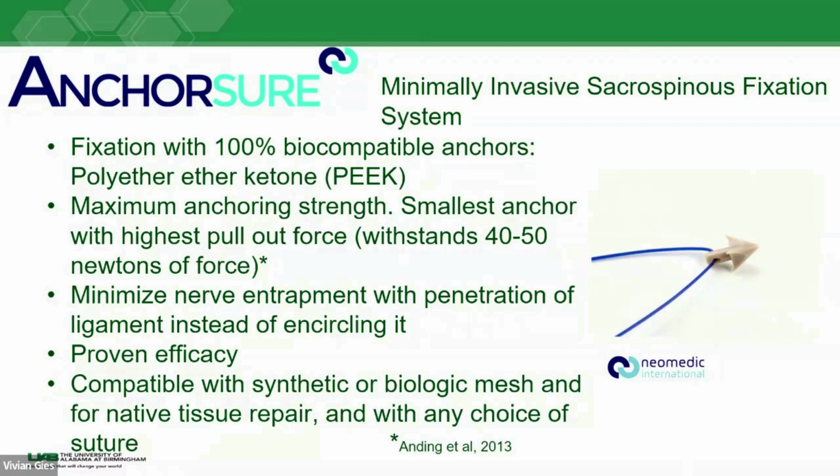Until very recently, I wasn't going to use it until I knew I could put 2 sutures through that burr. I used to have to shave an end and slide it through, but now they've made that little hole where you feed the suture a little longer, so you can easily place 2 sutures.